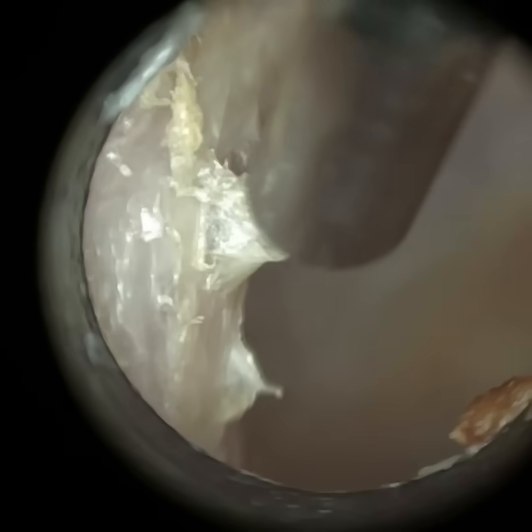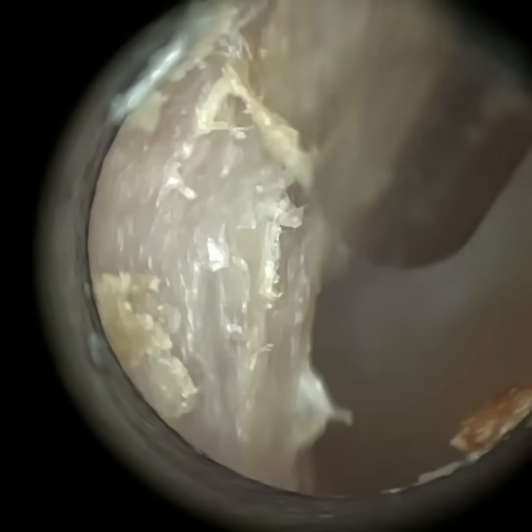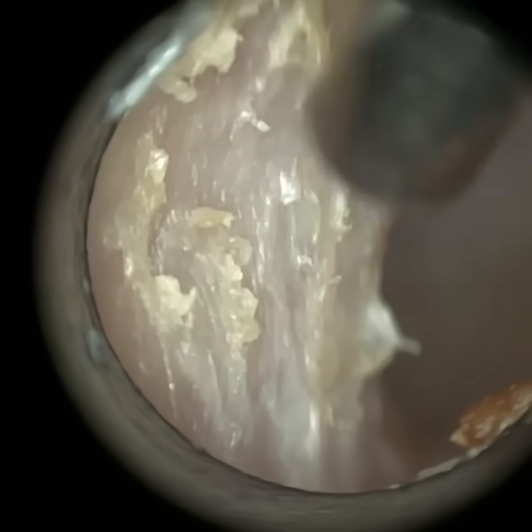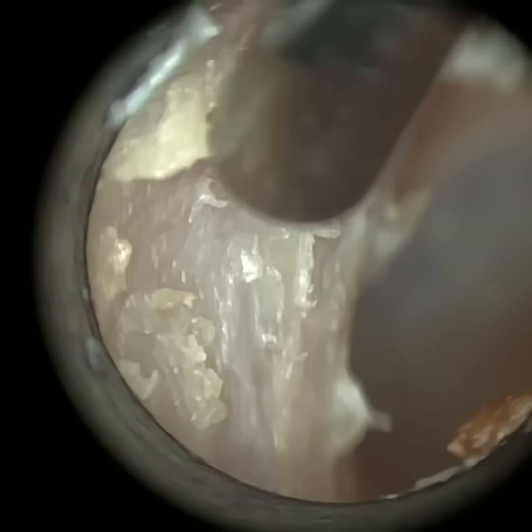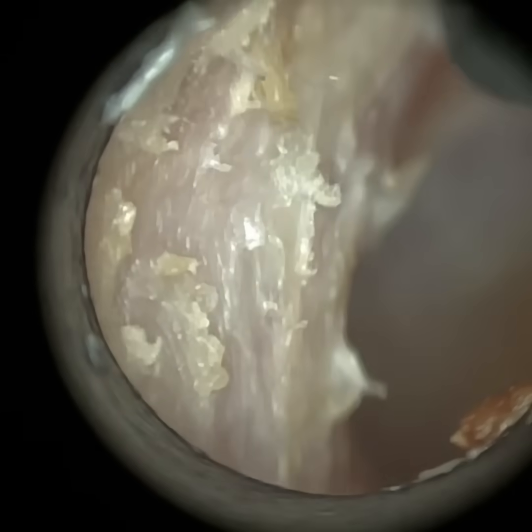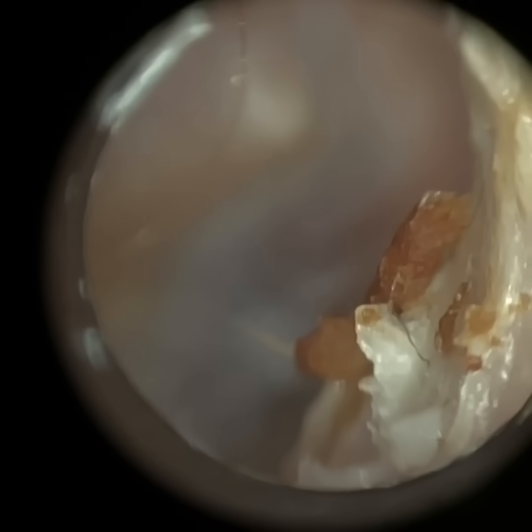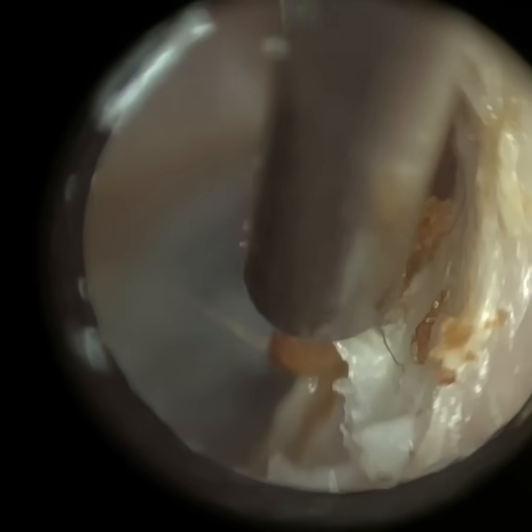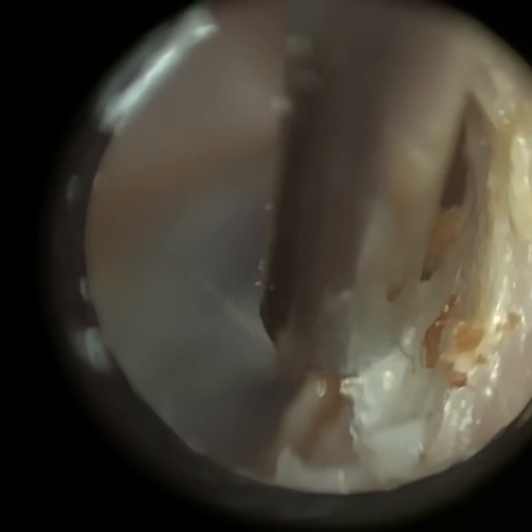You can see this patient's ear canal is very dry and cracked. Moving forwards, we've given them advice on water protection when they go swimming. They have got some swim plugs so they're going to start wearing those. Upon removal and servicing of the hearing aids, they noticed they've been having to change the wax guard on a more frequent basis since they started swimming, as they were filling up with all this dry skin and wax.